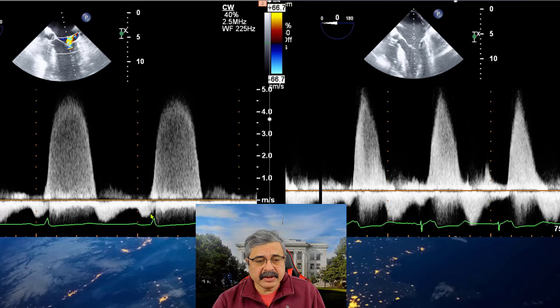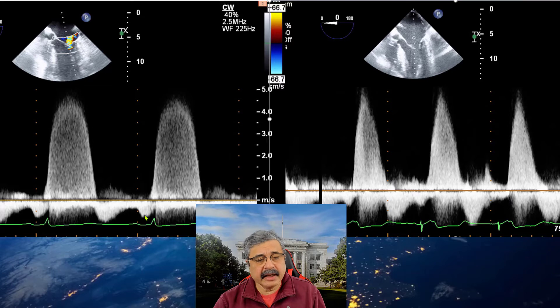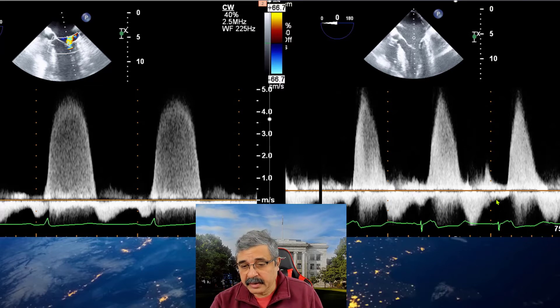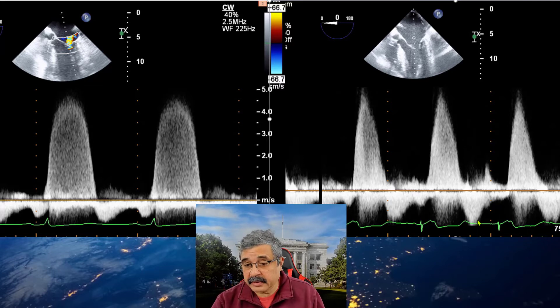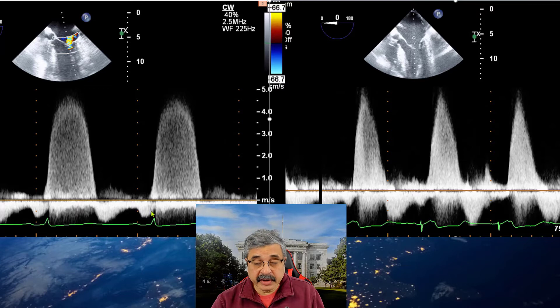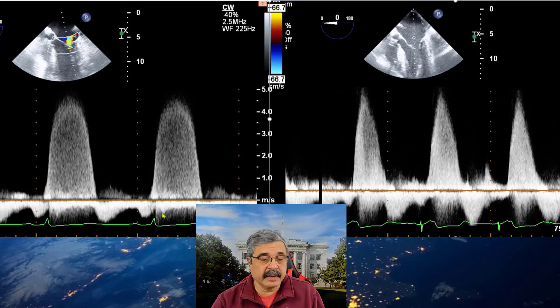More importantly, as you can see in this panel, there is an impaired relaxation pattern with both E and A waves being equal. However, in the second scenario, it has become a predominantly E-dominant pattern of mitral inflow, which implies that there is greater volume going through the mitral valve. An atrial-predominant pattern almost excludes severe MR.